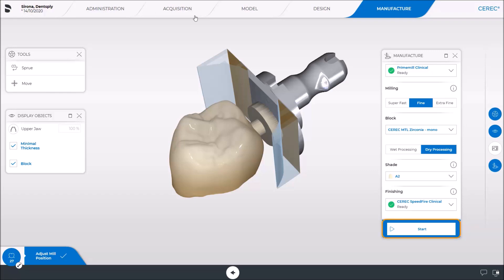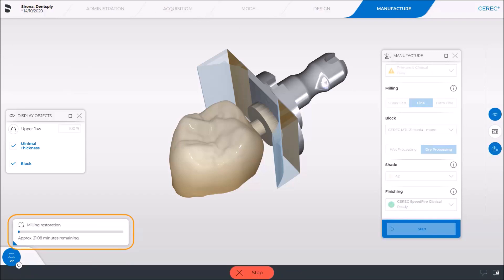Once we tap Start, the estimated remaining process time is displayed at the bottom left of the screen. This varies depending on the type and size of the restoration as well as the selected milling mode. Both fast and fine milling modes are available.